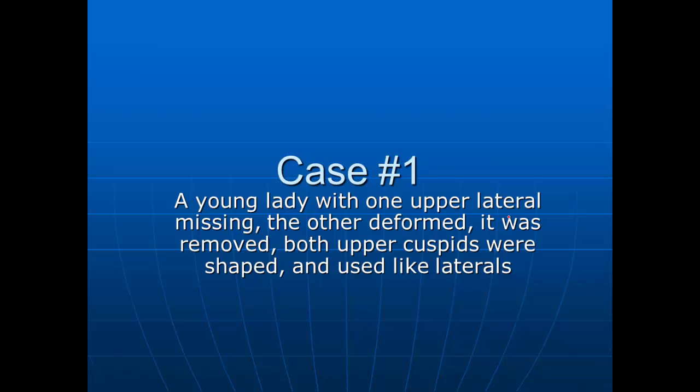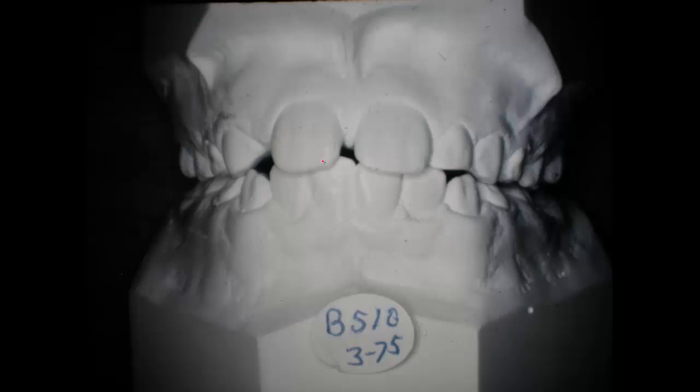I'll show you how we shape them when I get to those cases. They really look quite like lateral teeth. The ones on this young lady are just a little bit yellow in shade, which is not detracting too much, but we shape them up to where they really look like lateral teeth. And we'll go through and show you these.